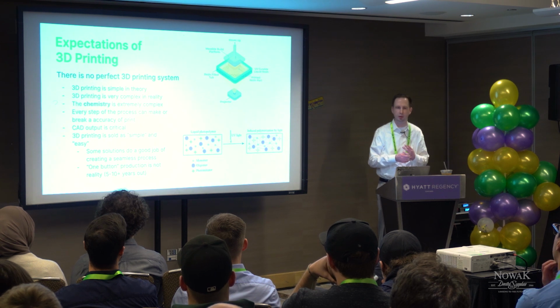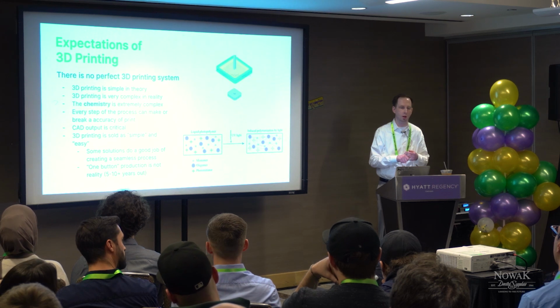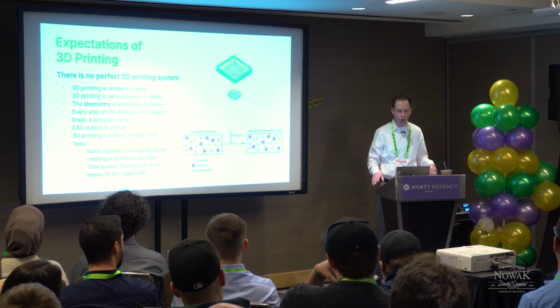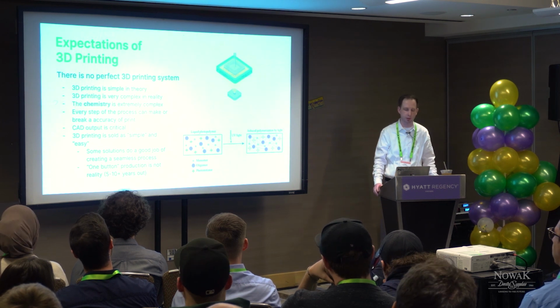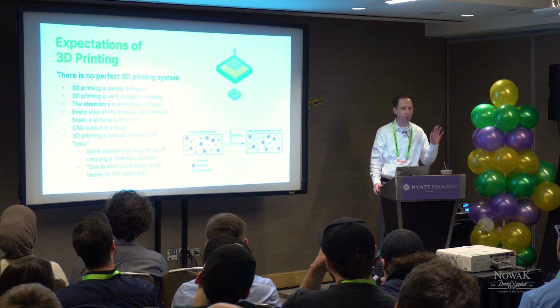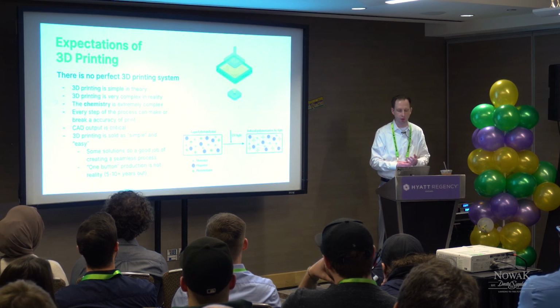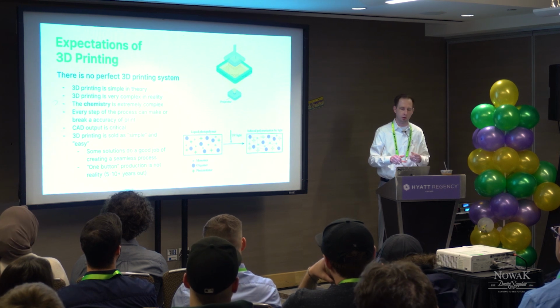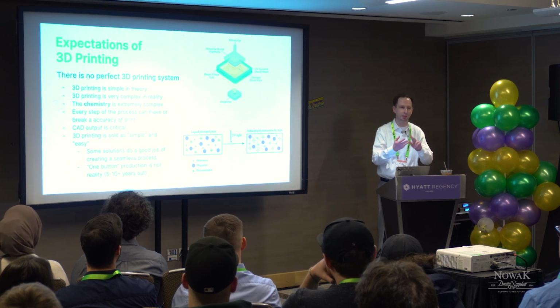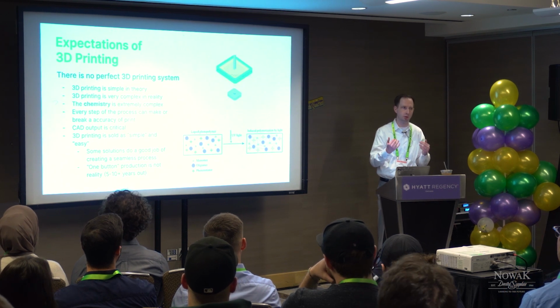I think we had 30 full-time chemical engineers and scientists on staff. And they don't even release that many products. It's truly an under-talked-about thing. This is a very complex process, and process matters. Not just the printer itself and what is baked into the process, but also the process that you are all deploying in your laboratories. Every step of the process can make or break the part's accuracy. That goes from how the resin is stored, if it's shaken up, how the tank's treated, job setup, which is critical, how it's supported. And the CAD is critical, especially for models.